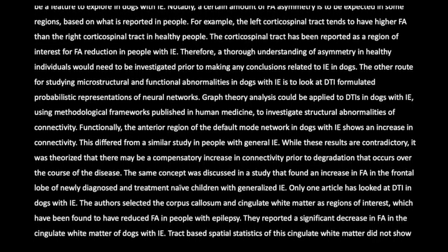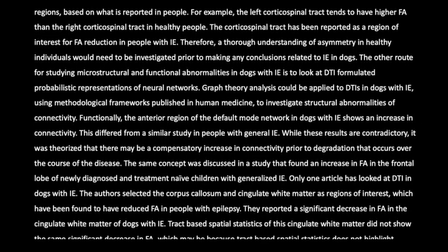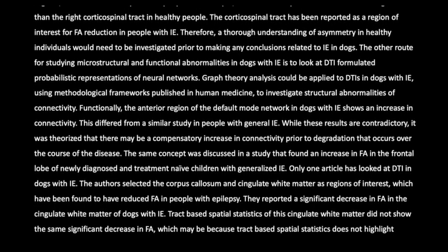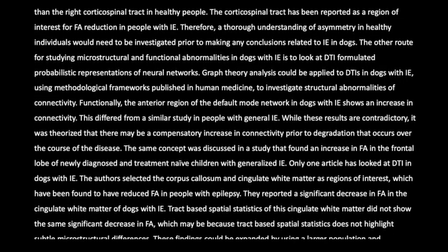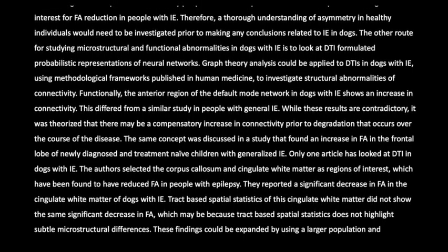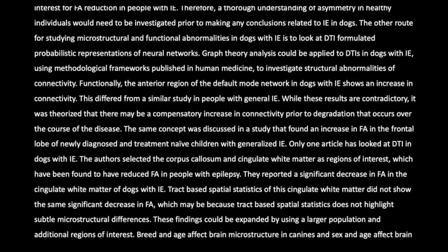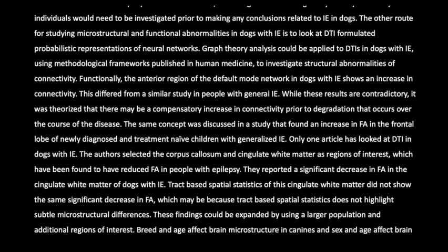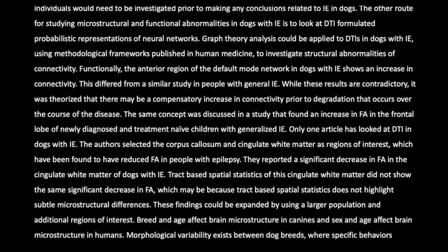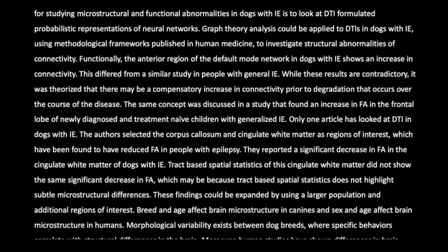Graph theory analysis could be applied to DTIs in dogs with IE, using methodological frameworks published in human medicine, to investigate structural abnormalities of connectivity. Functionally, the anterior region of the default mode network in dogs with IE shows an increase in connectivity. This differed from a similar study in people with general IE. While these results are contradictory, it was theorized that there may be a compensatory increase in connectivity prior to degradation that occurs over the course of the disease.